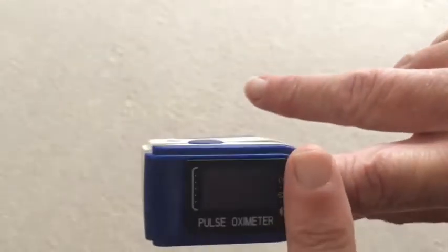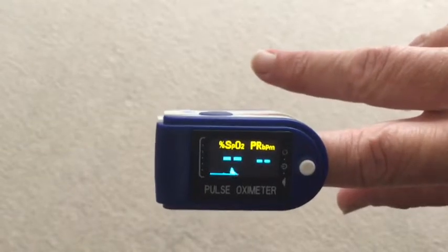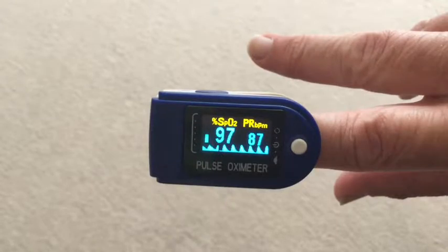This is a pulse oximeter. Using it is easy, just tap the white button to begin. You can see a chart of my heartbeat on the bottom and also that pulsating bar on the left represents my heartbeat.